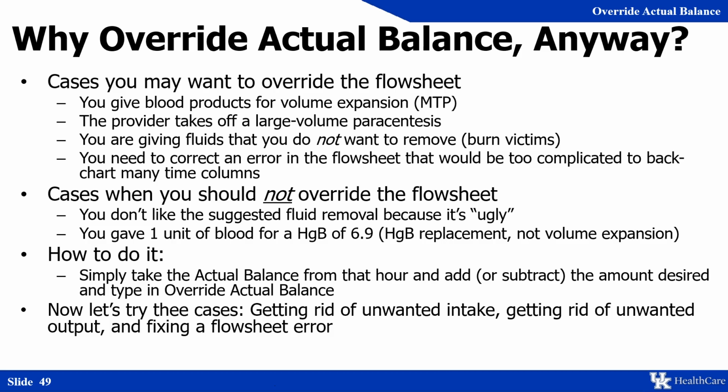How do you do actual balance override? All you do is you take the actual balance for that hour and you add or subtract the amount desired from override actual balance. So let's see these in practice on the next couple of slides.